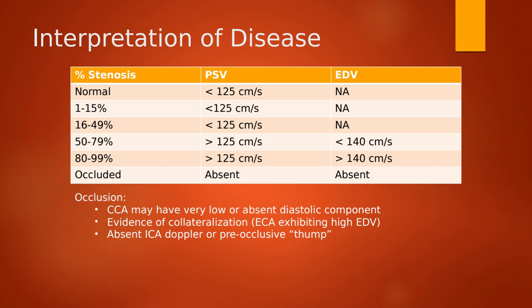So again, pretty straightforward information here. Once you know what you're looking at and what you're looking for, these exams are very straightforward, very simple, but it's very important to have precise Doppler skills. So we'll definitely be working on that as we go through this in lab.